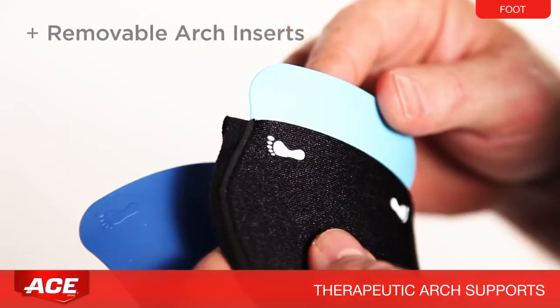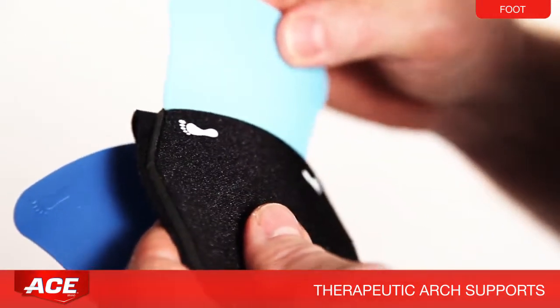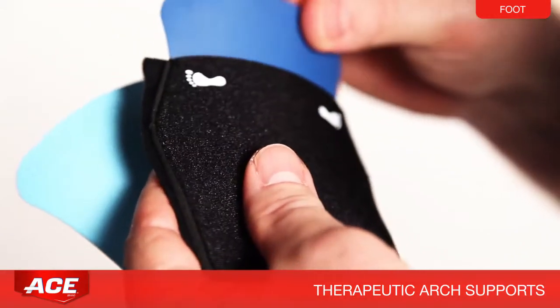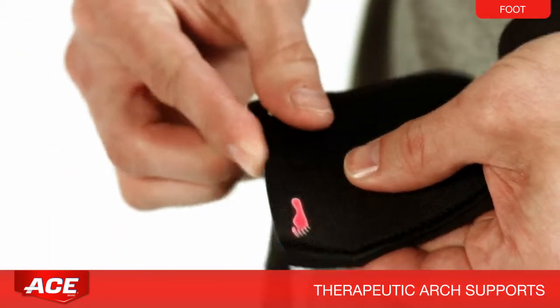Removable inserts provide a customized level of support. Use the darker blue insert for more support. To change out the inserts, simply remove one from the pocket and slip the other one in, matching up the feet icons on both pieces.